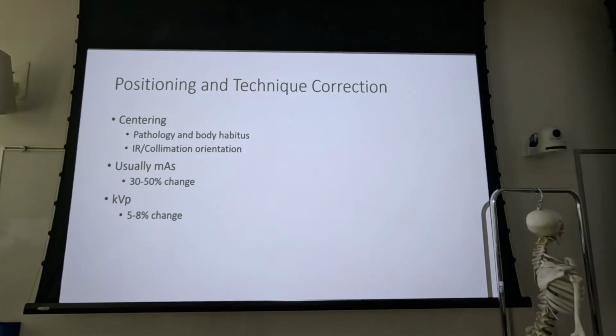How about, do they have an NG tube? You walk in the room, patient's got an NG tube. All right, are they feeding the patient or are they trying to decompress the patient? Well, if they're trying to decompress the patient, that NG tube's going to be hooked up to suction. If it's hooked up to suction, you look at the canister on the wall. If it's full of bile, that patient has bowel obstruction. So what are you going to do with your technique? Are you going to increase it or are you going to decrease it? You're going to decrease it, right?